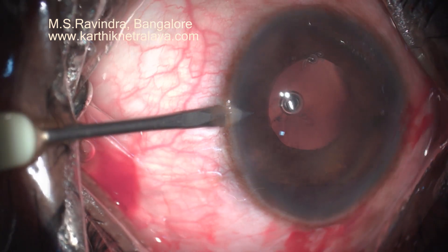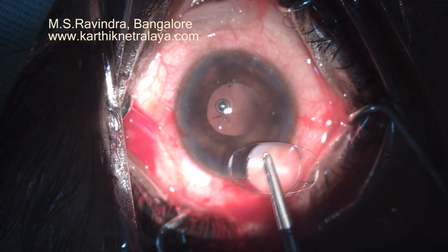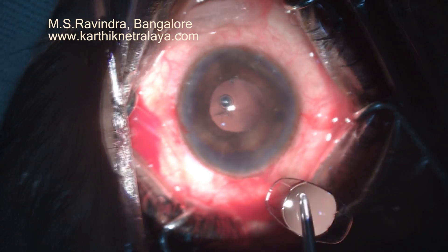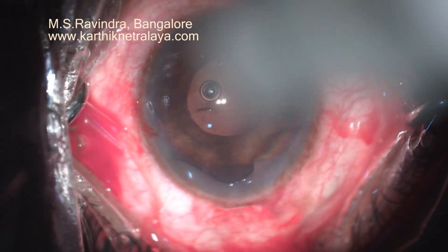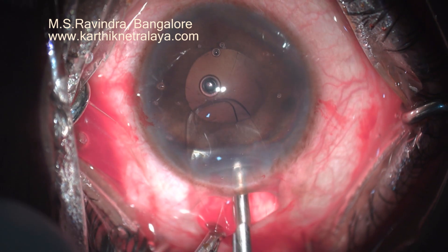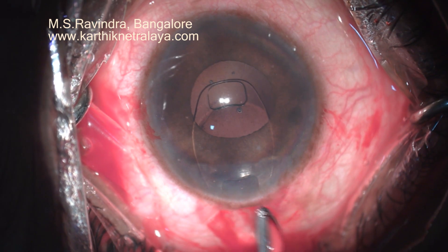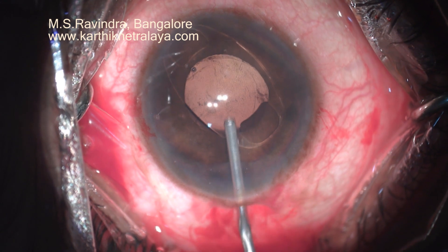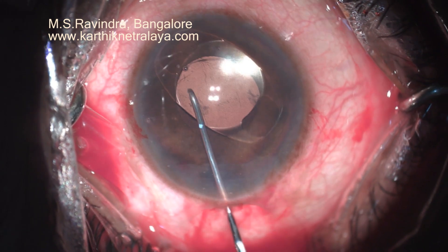Though the capsular bag is intact, I wanted to put an iris fixation — retro-iris fixation — in this patient because it is a progressive disease, a bilateral degenerative condition of the zonules and capsular bag. Even if I succeed in putting an endocapsular ring as well as a lens inside this capsular bag, it is likely to get dislocated in due course of time. It is a middle-aged lady. So the iris claw lens is placed inside. The capsule is intact with extensive zonular dehiscence. During surgery, I have ensured that the zonular dehiscence, which was pre-existing, did not worsen. I had prolapsed the nucleus out of the capsular bag in the very initial stage of the surgery.